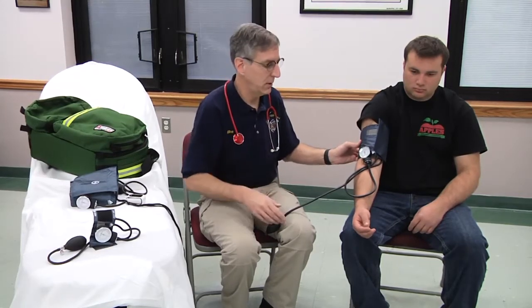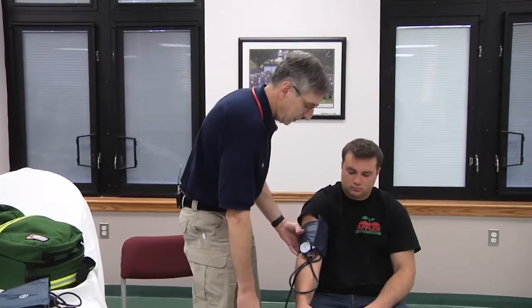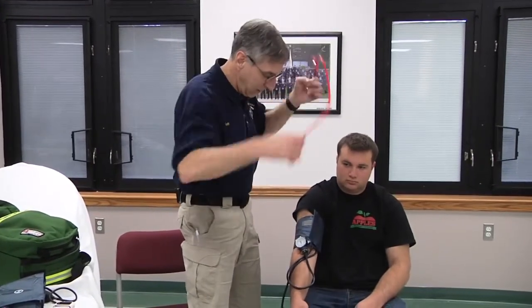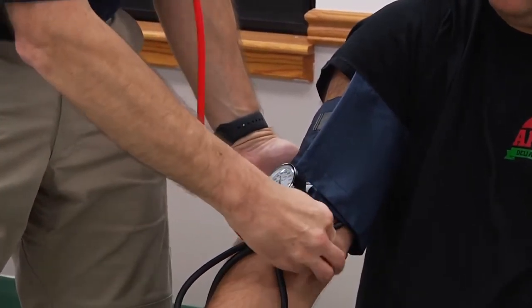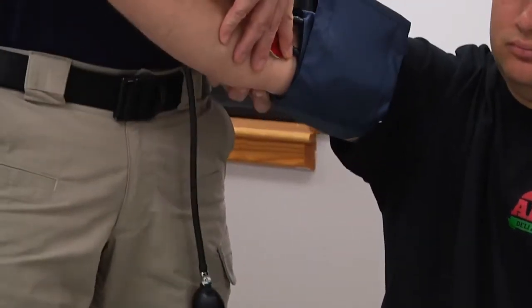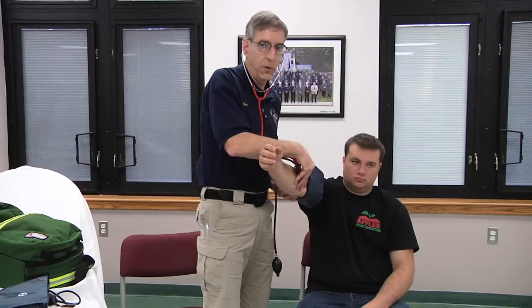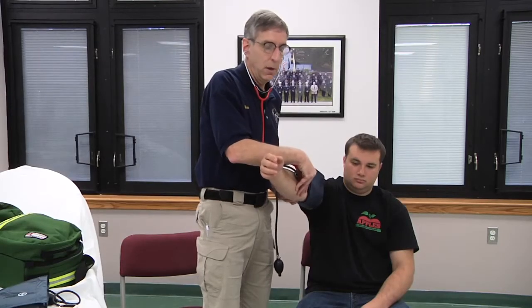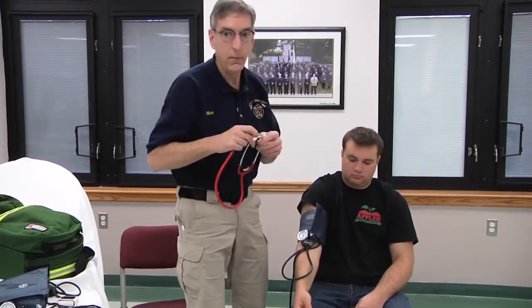We have a tendency at times, depending on our position, to be standing next to the patient and go to measure a blood pressure, and in the process elevate their arm into a position that's higher than the level of the heart. Higher than the level of the heart will give you a falsely low blood pressure. Lower than the level of the heart will give you a falsely high blood pressure.